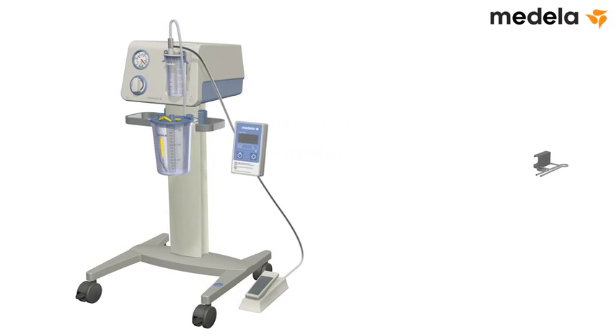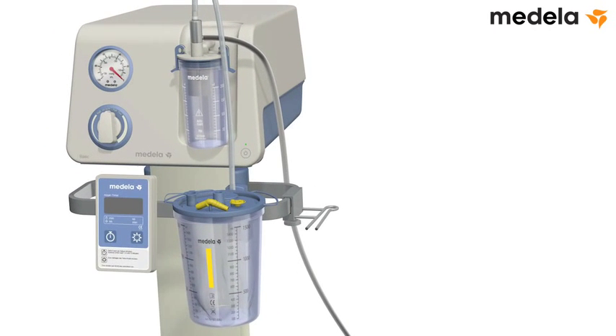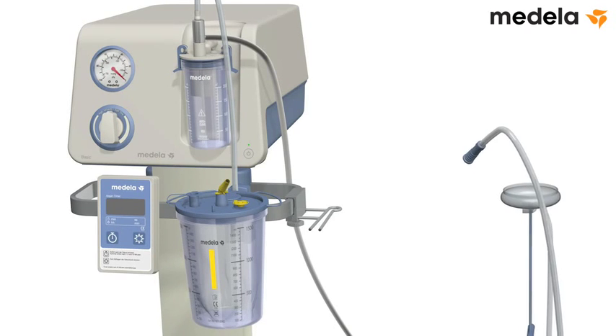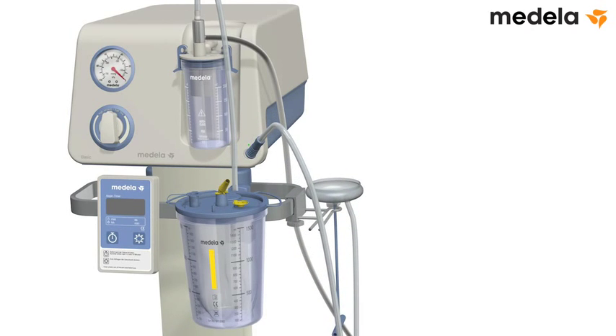Attach the APGAR timer on the rail. Attach the tubing holder on the rail. Disconnect the angle piece from the lid of the disposable liner and insert it into the patient connection port. Unpack the sterile single-use bird cup and rest it in the tubing holder. Attach the sterile tubing from the single-use cup to the angle piece.